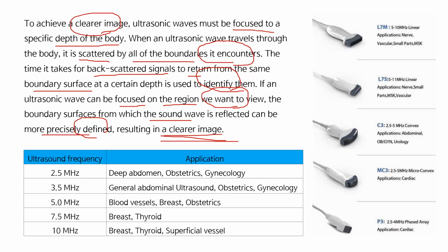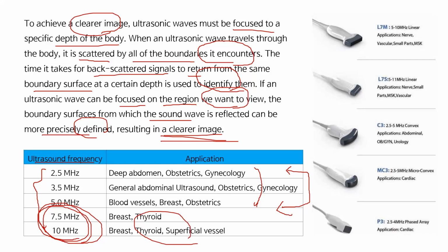As discussed before, for a smaller ultrasonic frequency, we use this ultrasonic wave to check the deeper region from the skin, and for higher frequency ultrasonic wave, we can use that to check the shallow organ from the skin.